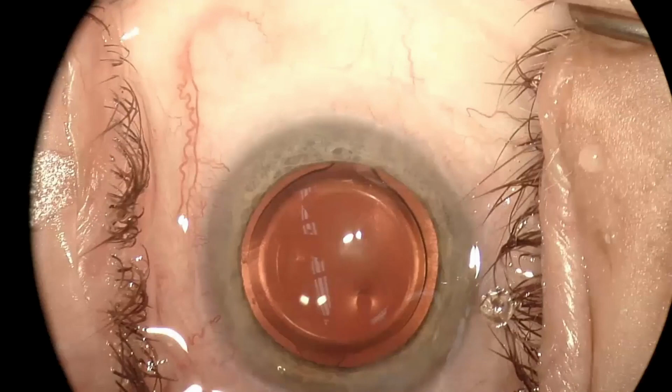Right now we're looking at the 3 windows of the stent, making sure they're all patent. It's kind of hard to tell in the video, but we could see it in real life, and they're hidden nicely behind the trabecular meshwork. Once the case is done, this is just pumping up the eye, making sure the lens is in good position, but you see some nice blanching at the top of the screen here for about 3 clock hours, showing that we've got the stent in good position and that this patient is going to get a good response from this procedure.